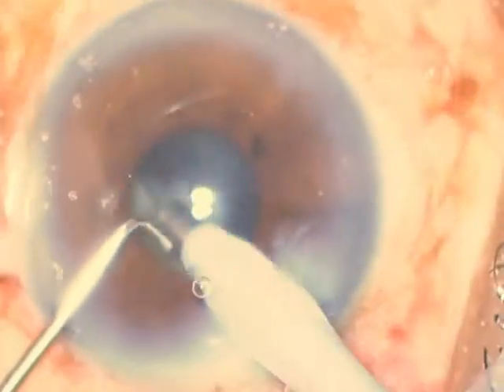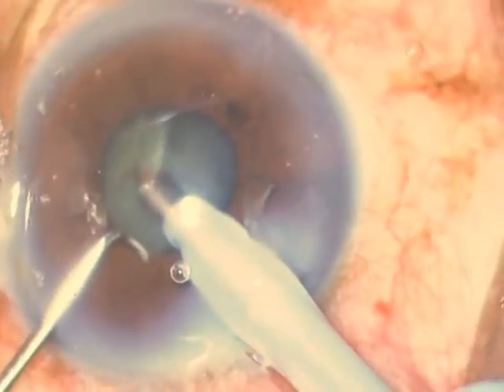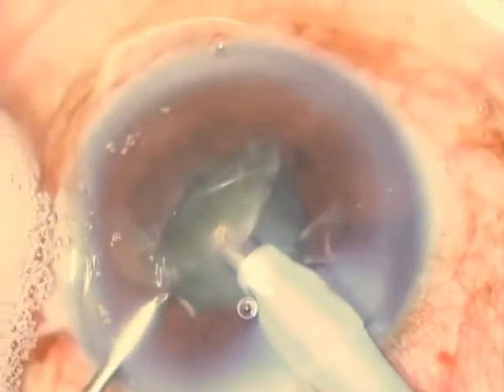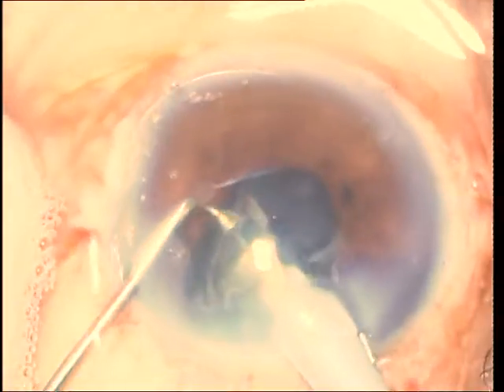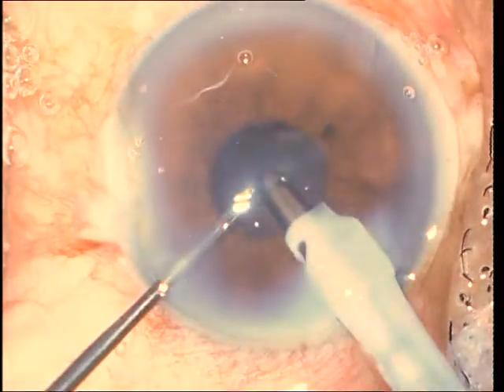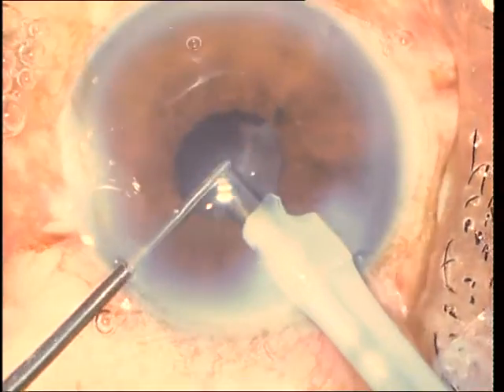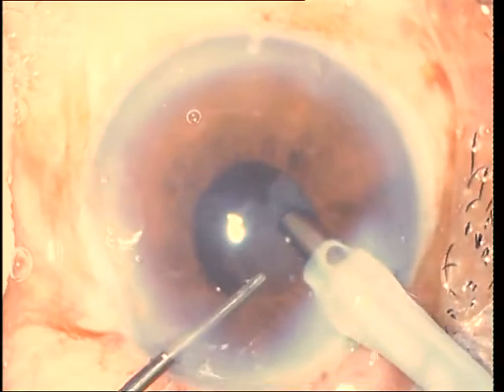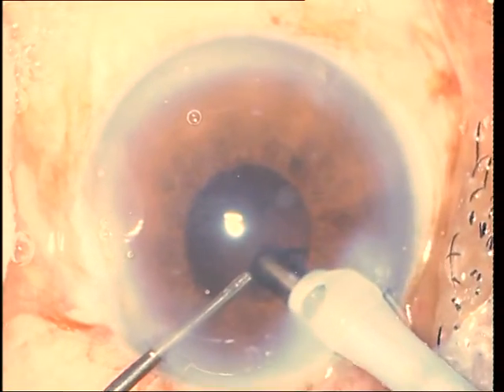The chopper I'm using is the Chang chopper. You can see it's like a micro finger — it's a modified Lieberman micro finger — and it gives you very good maneuverability. It's also very safe because of its blunt tip. There are also other good horizontal choppers available which may be used as well.